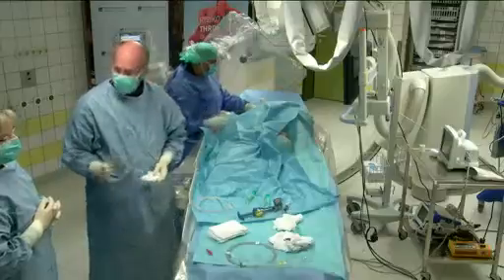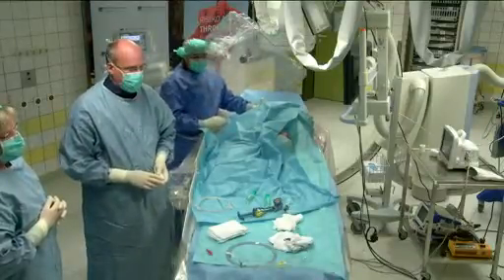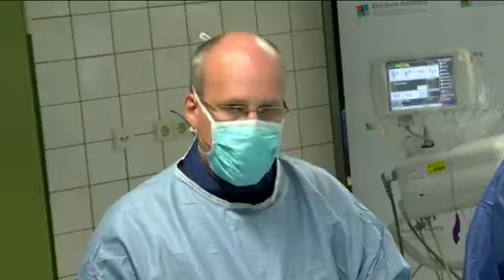Okay, welcome back here in the Arnsberg Clinic in one of our cath labs. Again, Marco, Mansi, and me are here to perform the second case. Also, one of our assistants is here with us, and we now have a 71-year-old patient with a Rutherford 5 situation with a necrosis of his D1 digit on the left side. This patient is on chronic dialysis, diabetic patient. And we now try to revascularize below the knee.